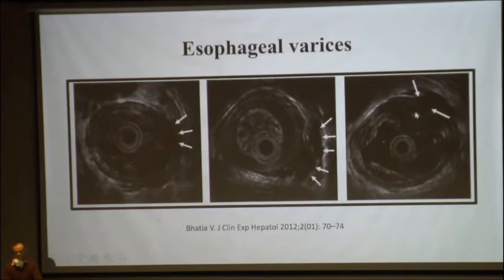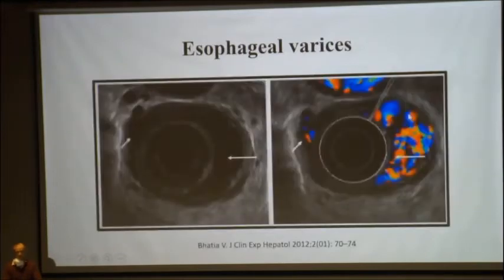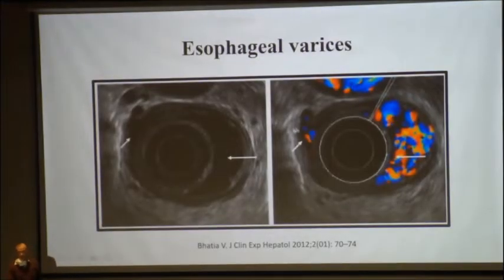They are connected with the peri-vessels with the help of the perforator vessels. A bigger view: these are the varices in the esophagus, which can be easily seen with the help of the Doppler mode of the EUS, and these are connected through the perforator veins to the peri-esophageal collateral vessels.